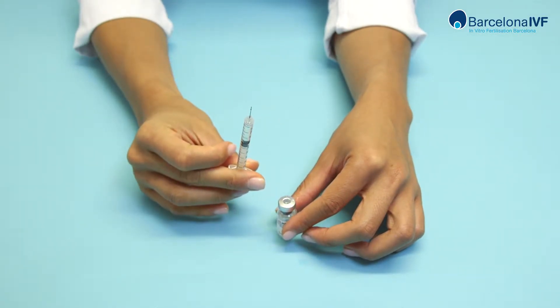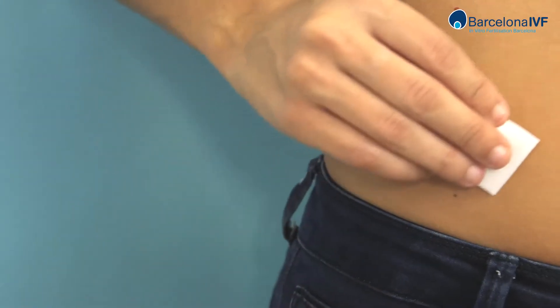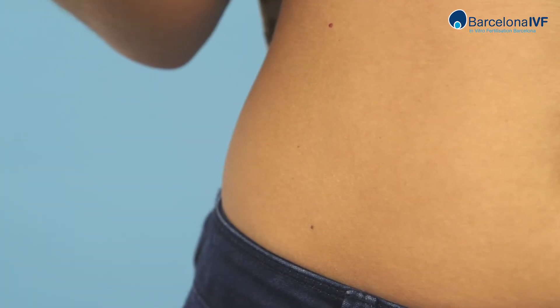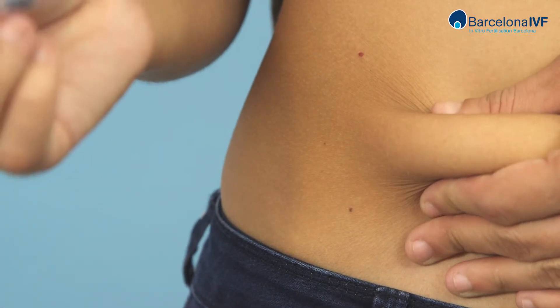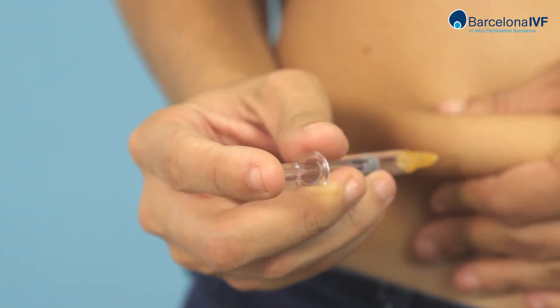Now the medication is ready for application. Clean the abdominal area with an alcohol wipe. Pinch the area where you want to apply the medication with one hand. With the other hand, take the syringe and insert the needle into the skin in a perpendicular position.